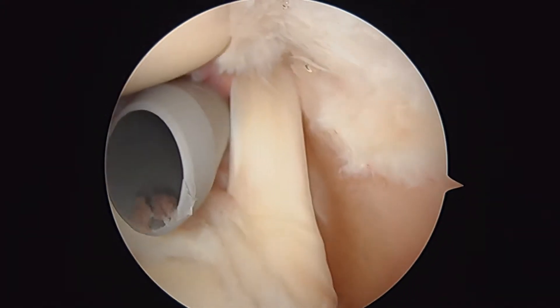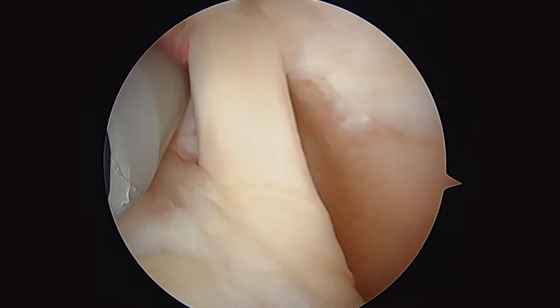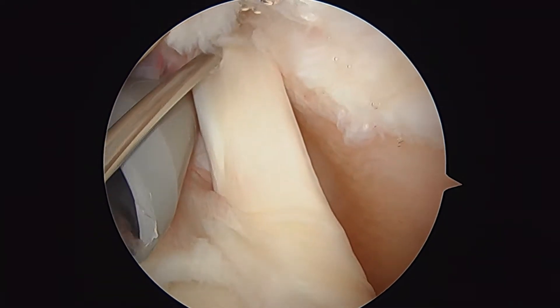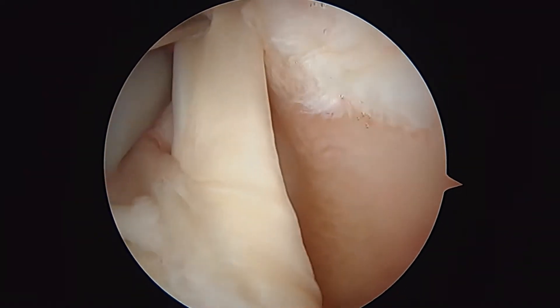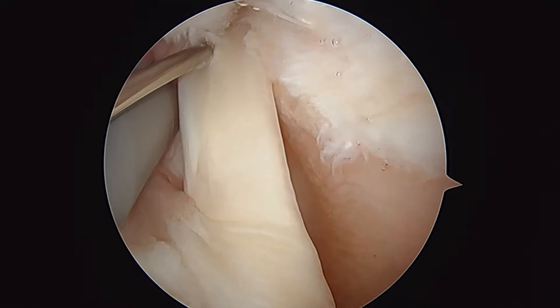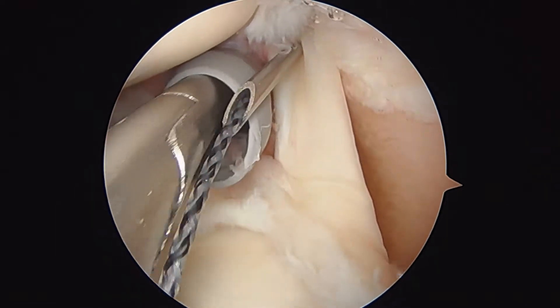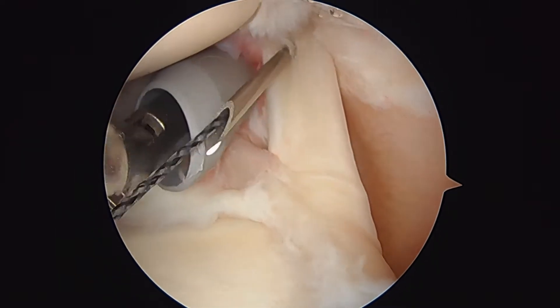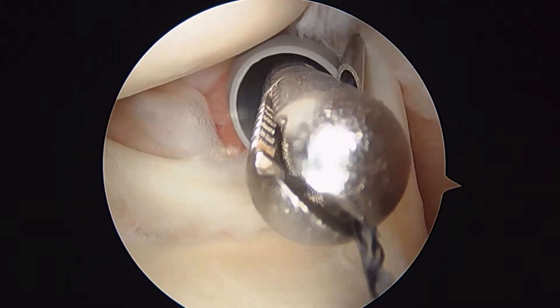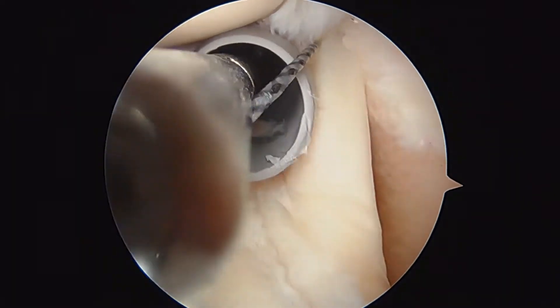There we are coming right through the middle of the biceps. We're going to feed a black wire called the shuttle relay. We'll take a grasper — put that in the gray cannula. There you can see the black wire that we're going to grab. With a little luck, we can just open and grab it right now. Then we'll hold still and I back the needle out. We do that so that the needle doesn't cut the black wire.